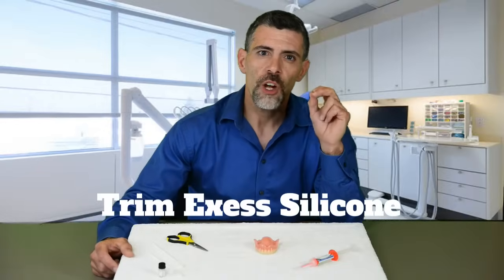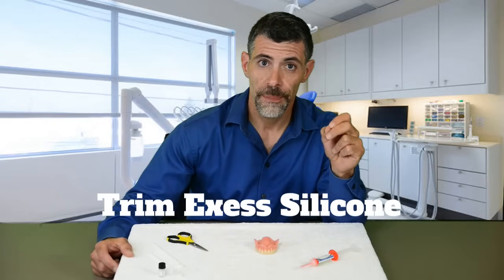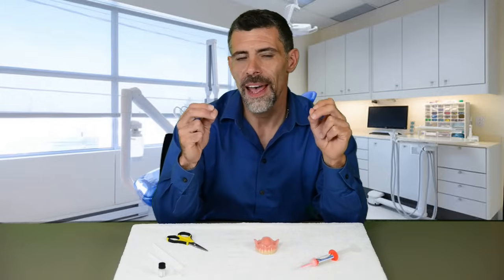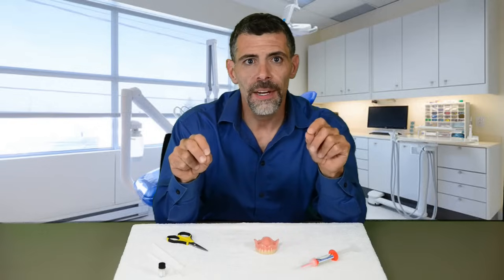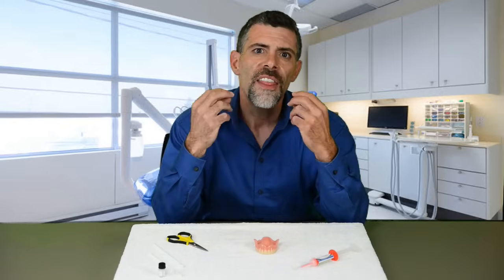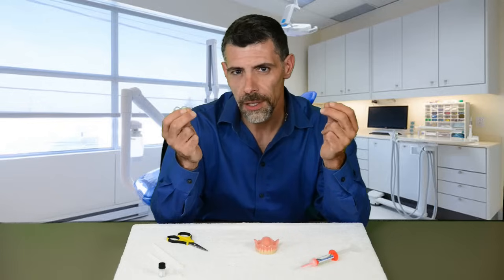Now let's talk about how and when to trim excess silicone from your denture. If you have a great fit but feel you need to trim excess silicone hanging around the edges — we call this flashing — you may trim it. But keep in mind that over-trimming can break your seal. Think of the silicone on the edges of your denture like a snorkeling mask.